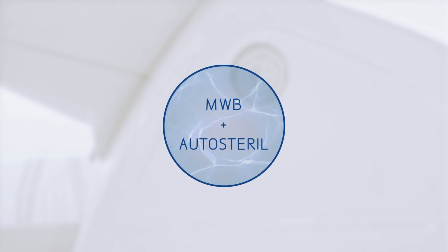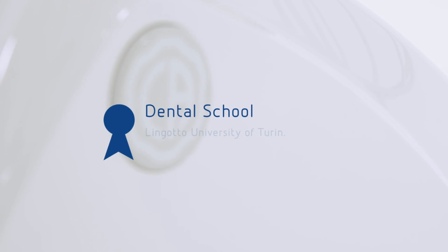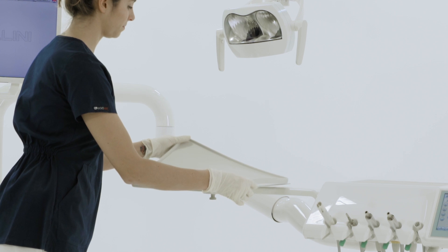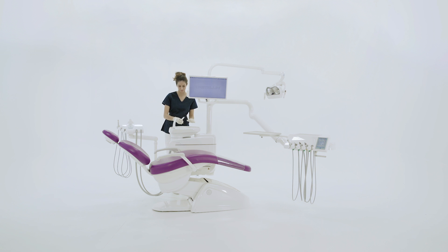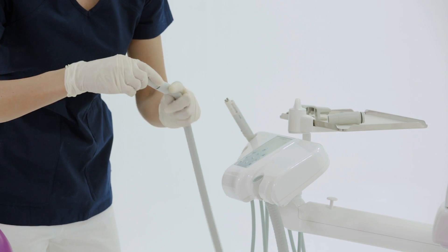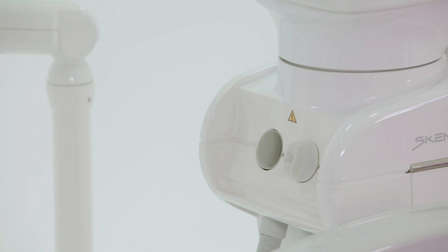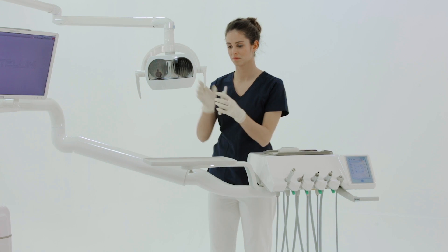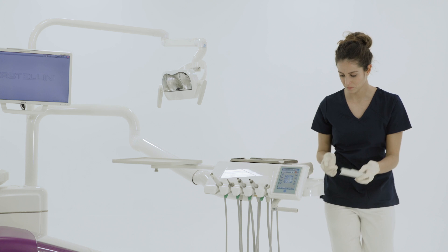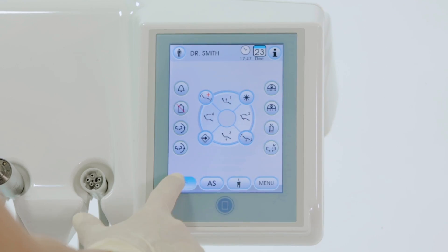Moreover, when combined with an auto-sterile intensive disinfection cycle, it ensures excellent hygienic quality of the water delivered on the instruments. To complete the tasks at the start of the day, the assistant puts back the sterilized and disinfected items and applies the required disposable covers. Before treating the first patient, a time-flushing cycle is carried out.